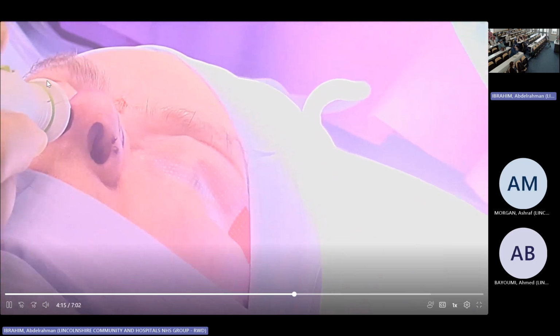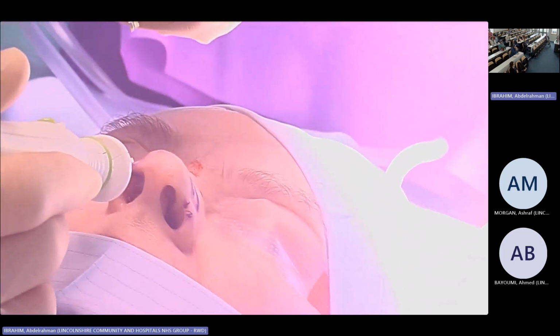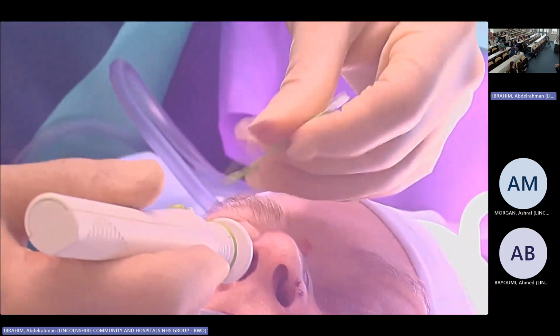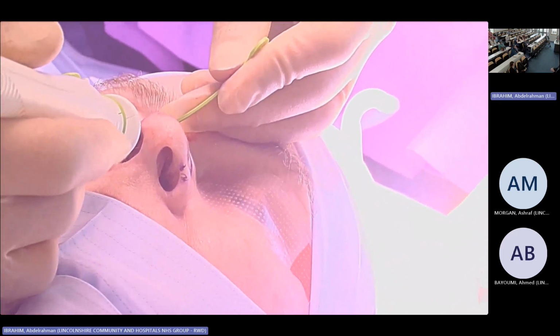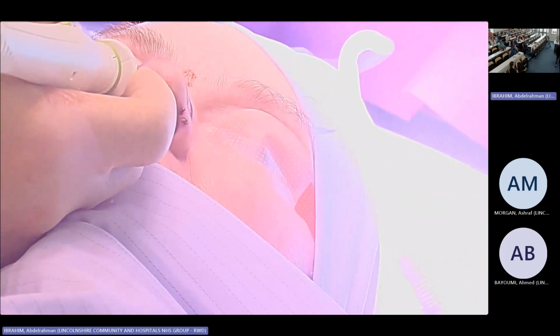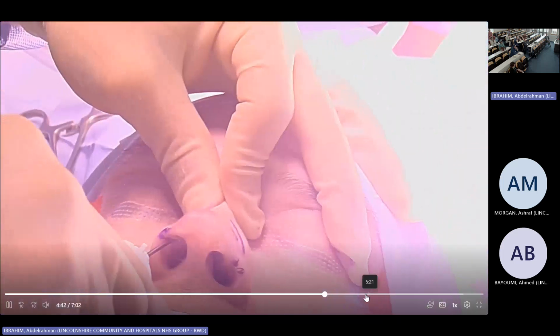And there is a guide at the end of the introducer, which is those. So those should be in the same direction of the nasal valve. I'll tell you in a minute. When we go to the hands-on, this will be more clear. And then you release. I'm going to show you the other side.